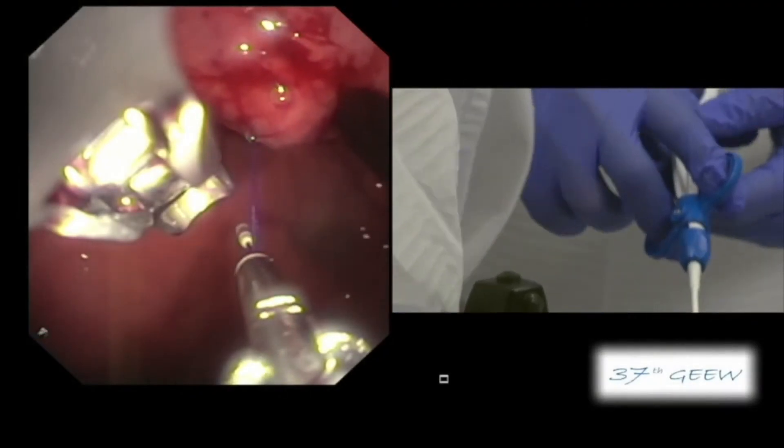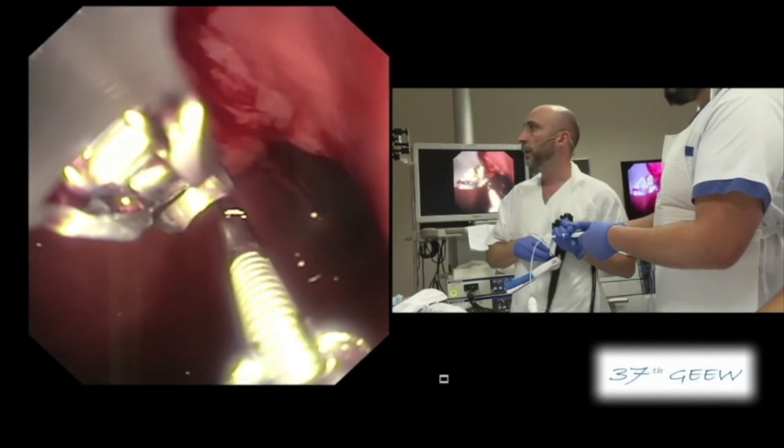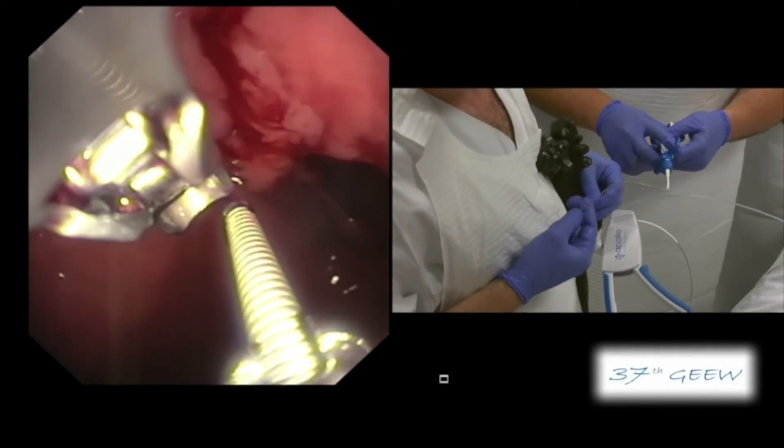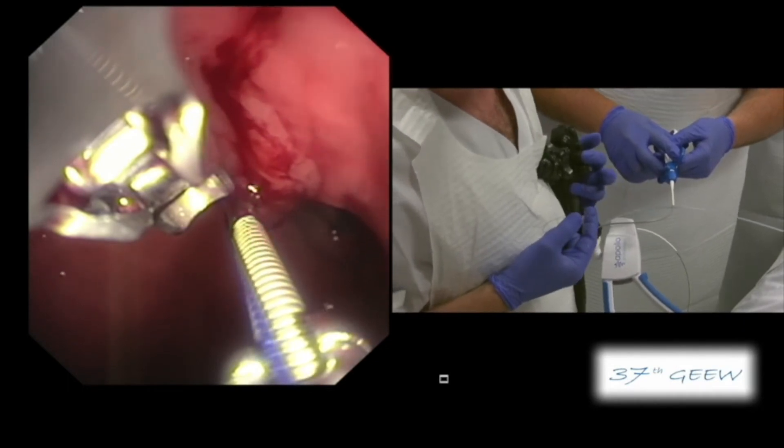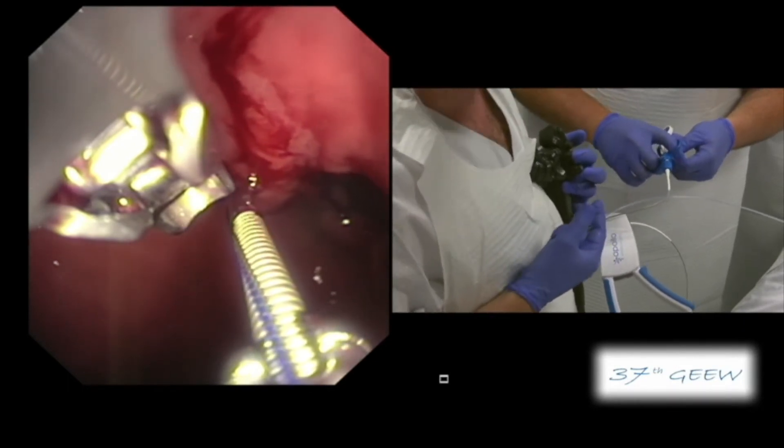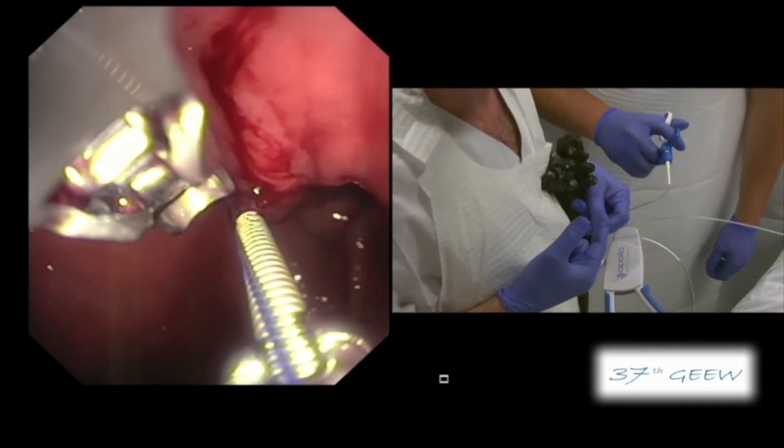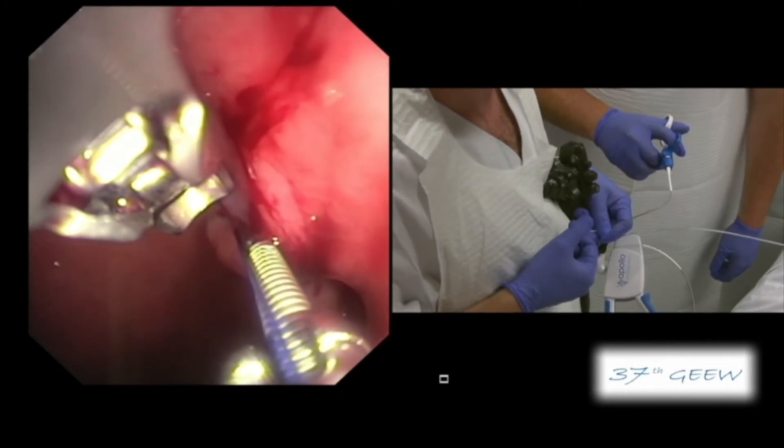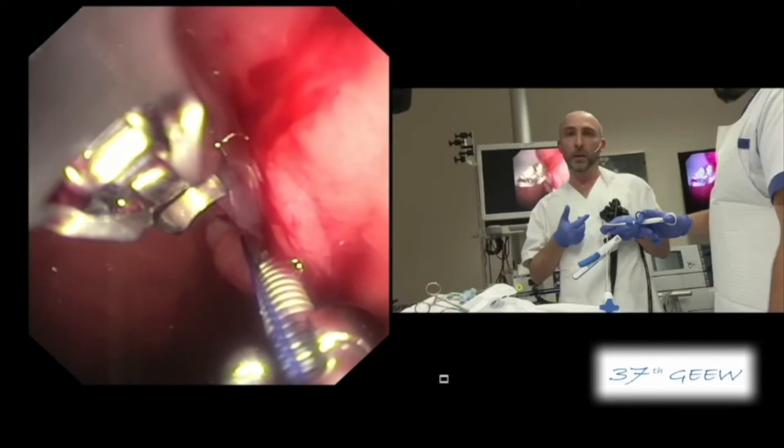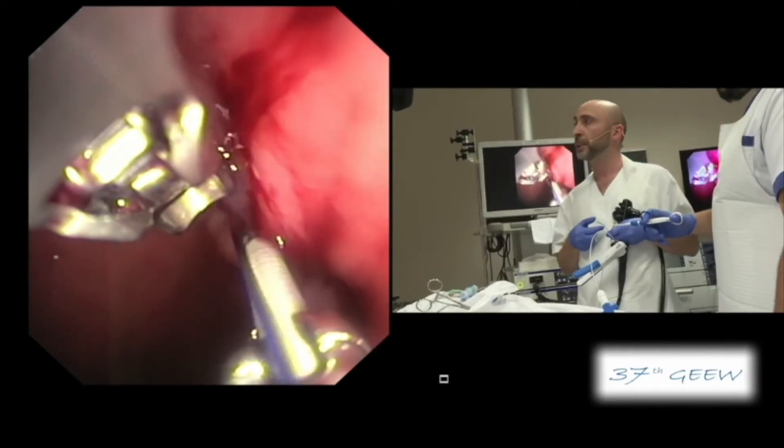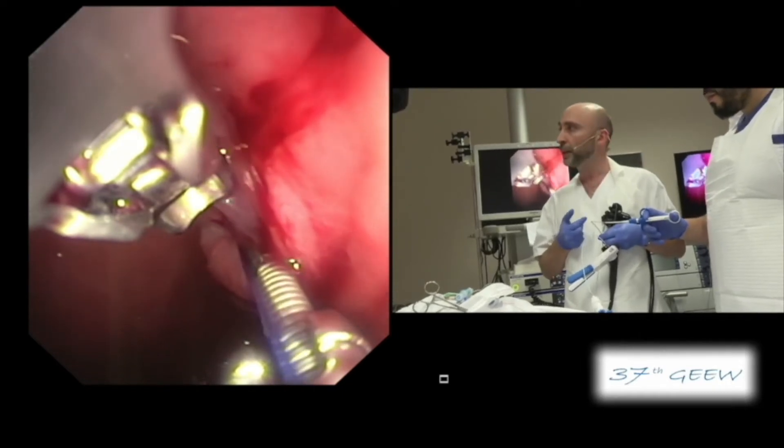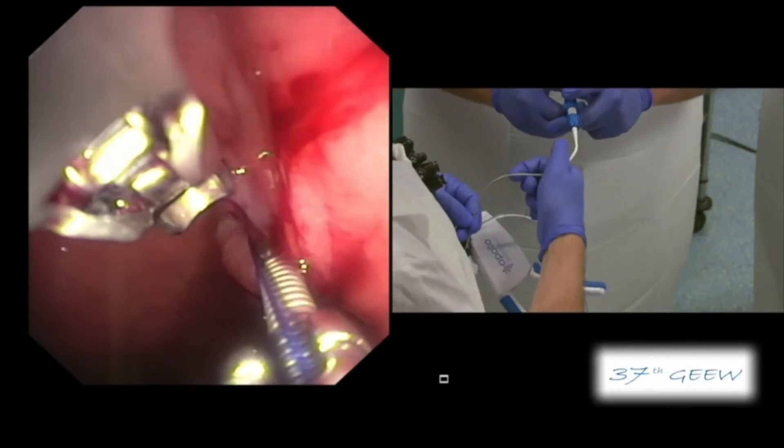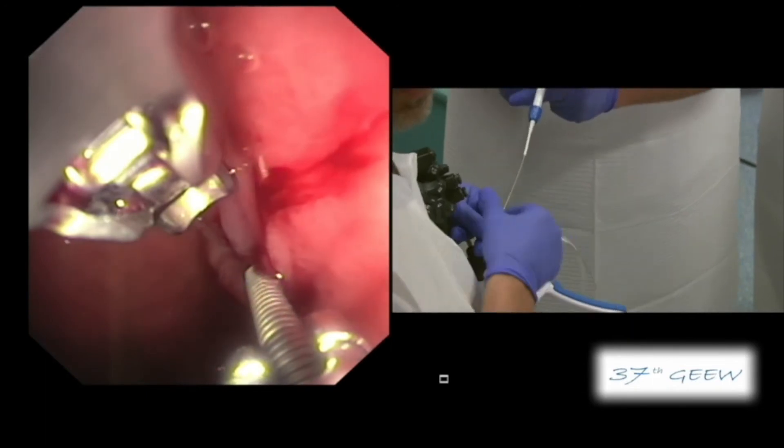So I will slightly pull back and I will show you what will happen. We are there. So now I exchange the hands. I am keeping the cinch tightly and I am pulling. It is always useful to remove the CO2 but both channels are occupied, so it will not aspire everything. You see if I had placed the fifth one it could be very tight. So I am not pulling too much like in the gastric bypass revision procedures. It should be tight but not too tight. He is going forward now with two hands. We should avoid the angle here. And it is done.